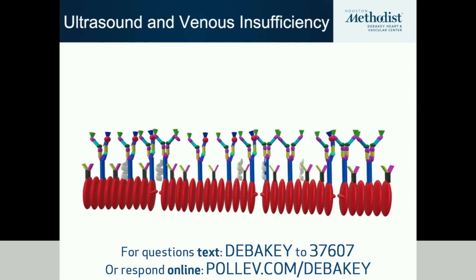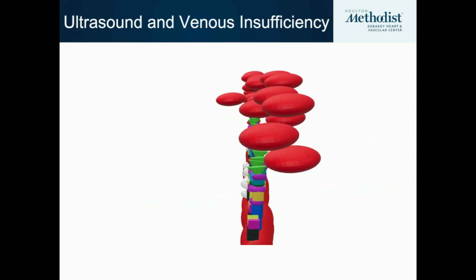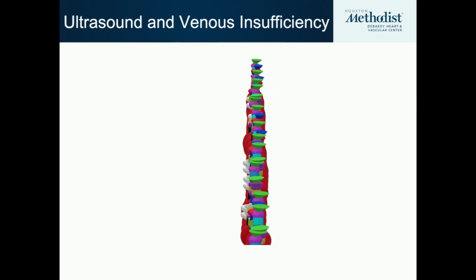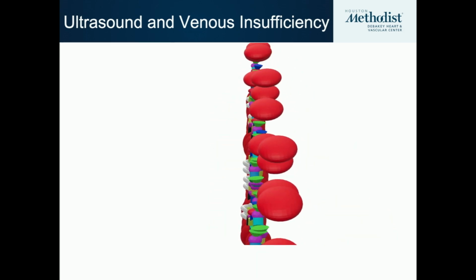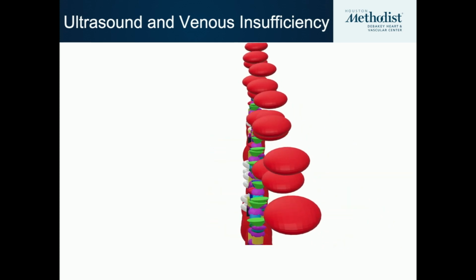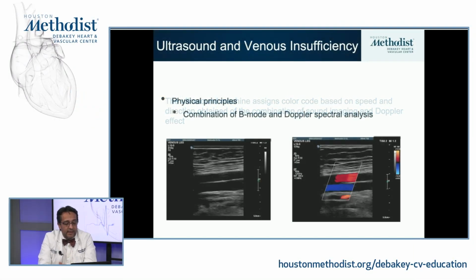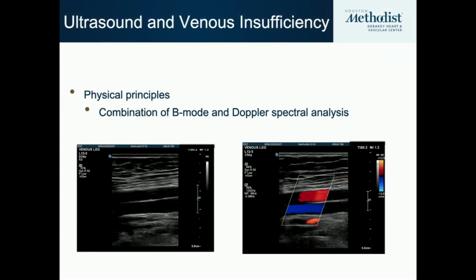And then the machine itself is going to give a color, an artificial color, and that's why we see red or blue. It's not because it's red or blue. As we can see here, the bloodstream travels in the same way, dissipating the energy at the tip of the initial laminar flow, and that is what is going to give the Doppler effect that will allow us to give an amount of velocity or color, etc. And the perfect angle is a 60 degree angle. That's what the equation says. So the ultrasound, as I just mentioned, is going to assign the color artificially, and we can see here these images, with or without color, according to the Doppler effect that is being captured from the vessel in question.